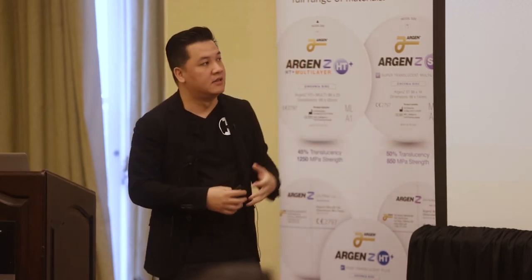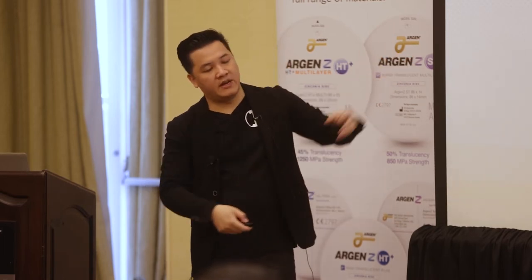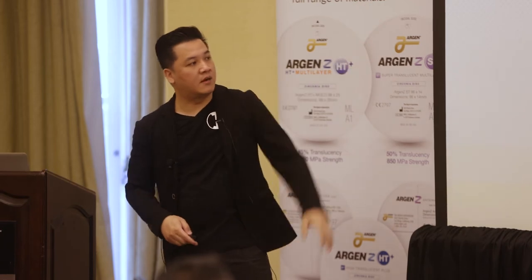You can sinter zirconia, you can sinter powdered metal, you can press Emax, you can cast, you can print and press, you can mill Emax. So there's a couple different pathways, and then they kind of converge again where you fit and finish. And nowadays with ceramics, it's moving more towards monolithic, where you're just doing more glazing rather than layering a lot of stuff. And then you go out for delivery. So this is kind of your roadmap here.